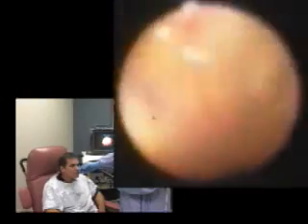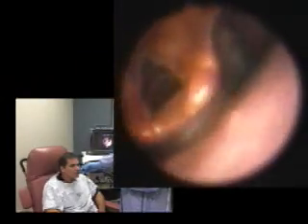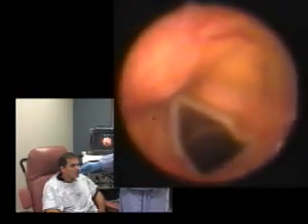You may want to swallow one more time, Chuck. Very good, very good. So we go back and interrogate the area, vallecular space clean, and piriform sinus on this side is just barely stained, and on this side the same. And the cords are clean, and inside the trachea is quite clean, and I don't see any residue.